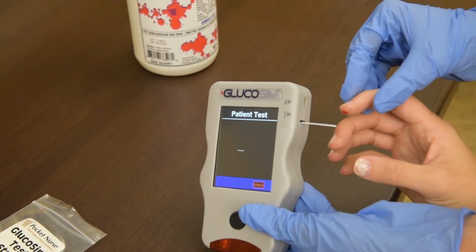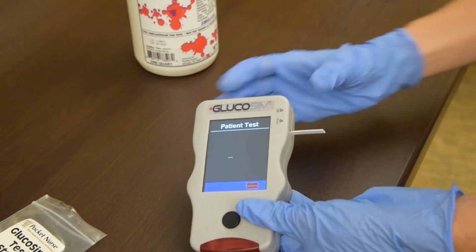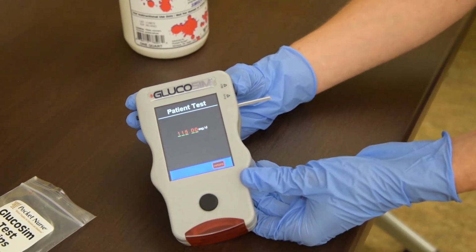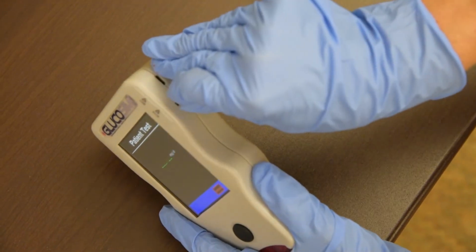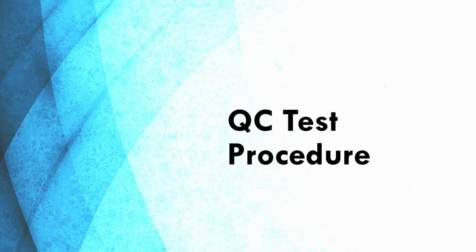Apply simulated blood to test strip. After the preset time elapses, the pre-programmed value for trial number 1 will display. Remove the test strip. Stay on the screen and repeat previous steps to obtain the second trial value.